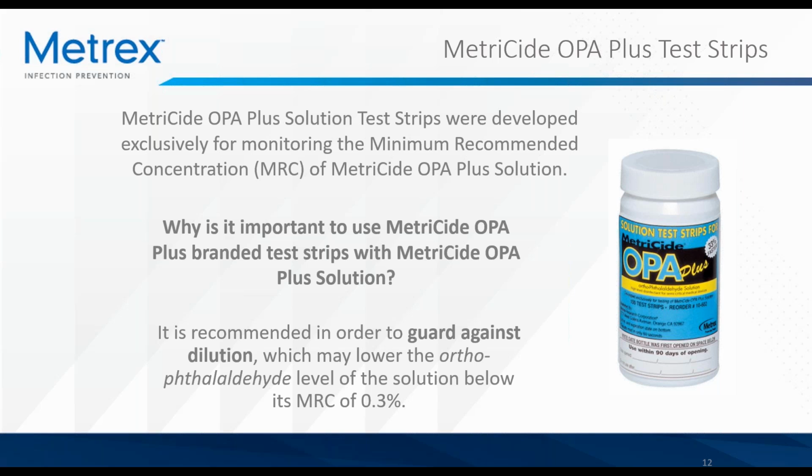MetriCide OPA+ solution begins with an initial concentration of 0.6% OPA. Over time and after each use, the amount of OPA in the solution decreases. Once the concentration of OPA in the solution falls below the MRC, we can no longer count on the solution to be effective at killing all the organisms necessary to achieve high-level disinfection. Use of MetriCide OPA+ test strips is necessary to ensure the level of OPA in the solution doesn't fall below that MRC of 0.3% OPA.